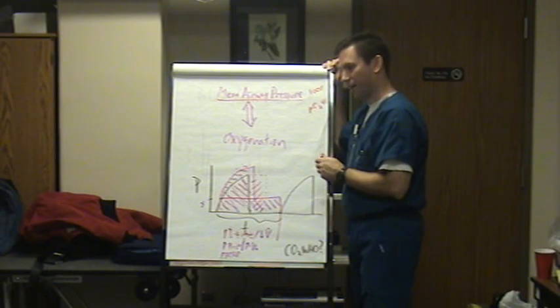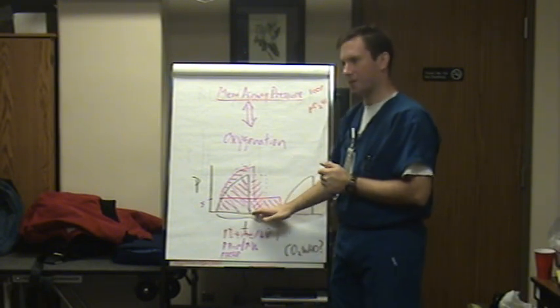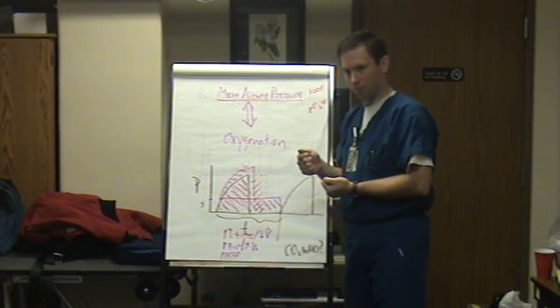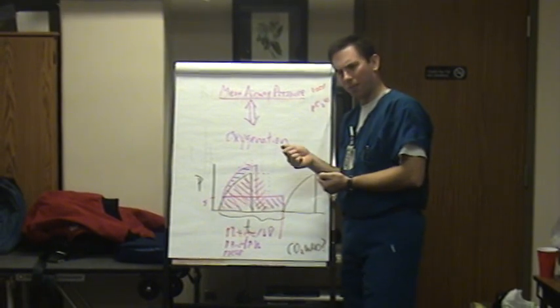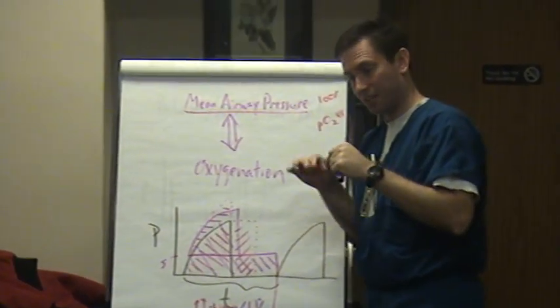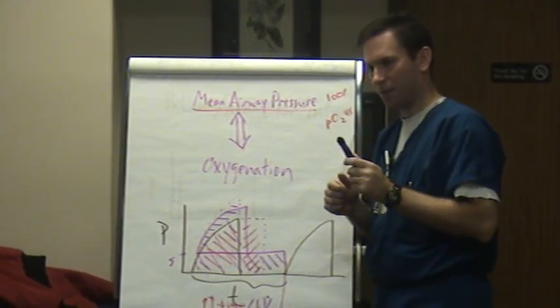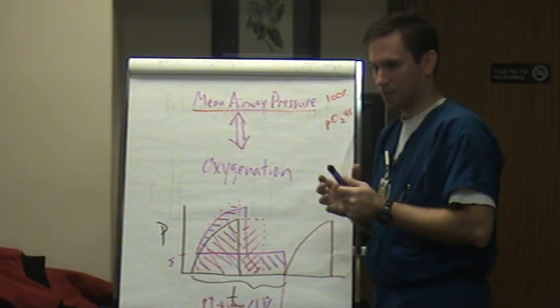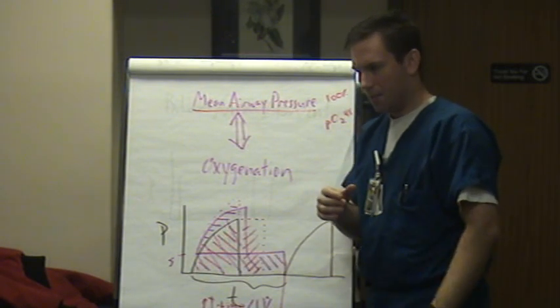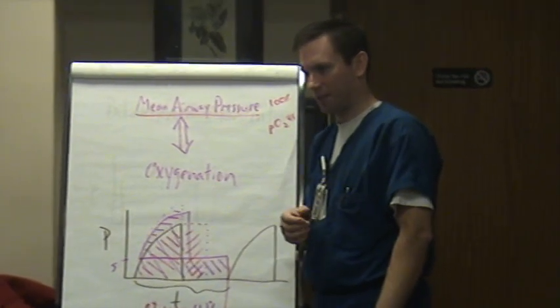Then you're impairing delivery. So what would you do if the therapist is saying we need more PEEP, and they can look at the ventilator and see the compliance is getting better with more PEEP, but every time you go up on the PEEP, the blood pressure drops, heart rate's going up, and the SAT even drops. How can we fix that when the therapist says, look, the compliance is better, meaning the lung likes it. You know, the stretch of the lung is easier now that we have PEEP. But according to the vital signs, we're killing the patient. What can we do to fix that end of it?